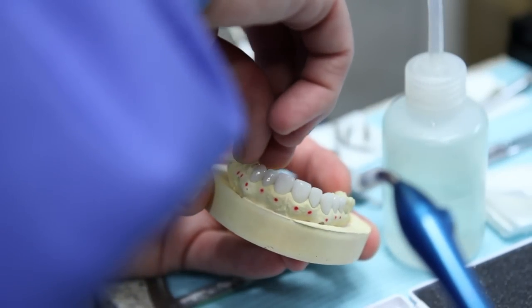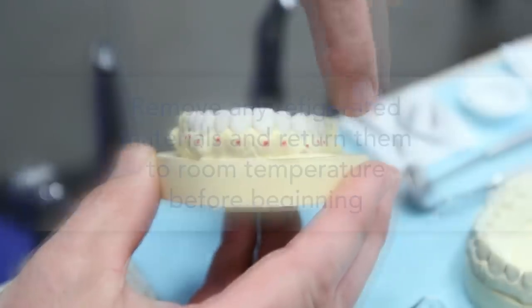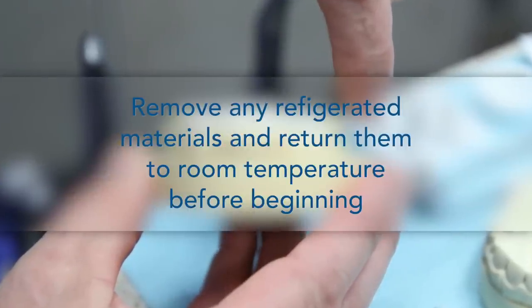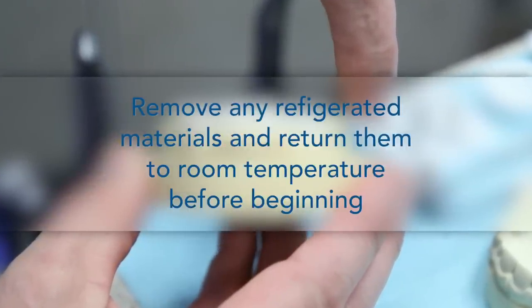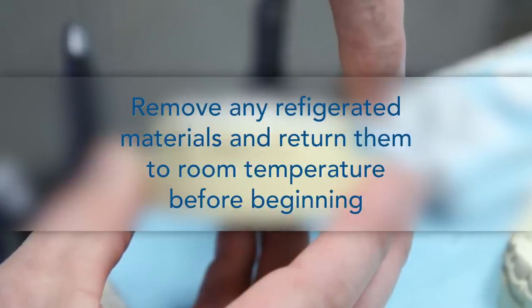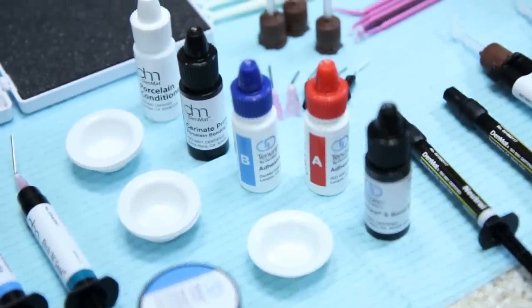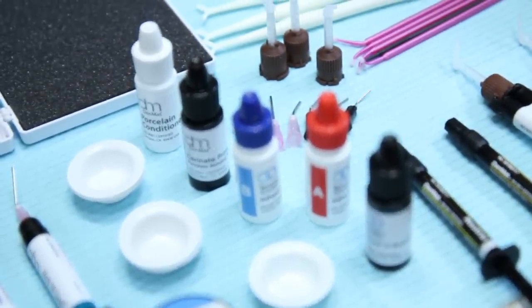The day before the appointment, dry-try lumineers on a stone model to ensure proper fit. Remember to always remove Ultrabond Plus from the refrigerator about one hour prior to use to allow it time to return to room temperature. If Tenure A and Tenure B are also refrigerated, bring them to room temperature as well and shake vigorously before use.